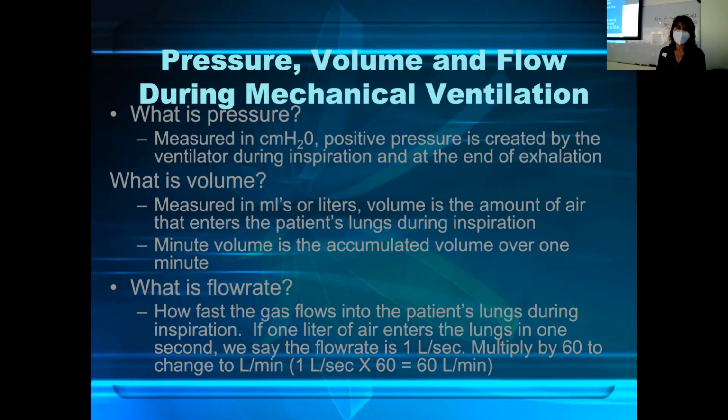So we're measuring that, and then we measure minute volume all the time. So we're measuring not only the air that goes in and out each breath, but we also measure what's going in and out over a minute.